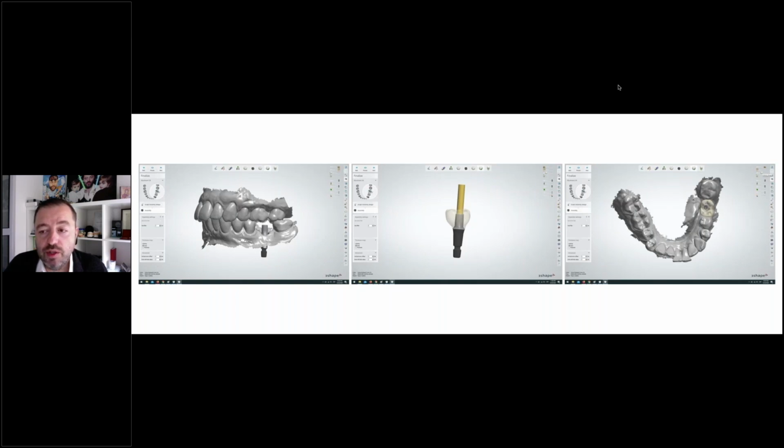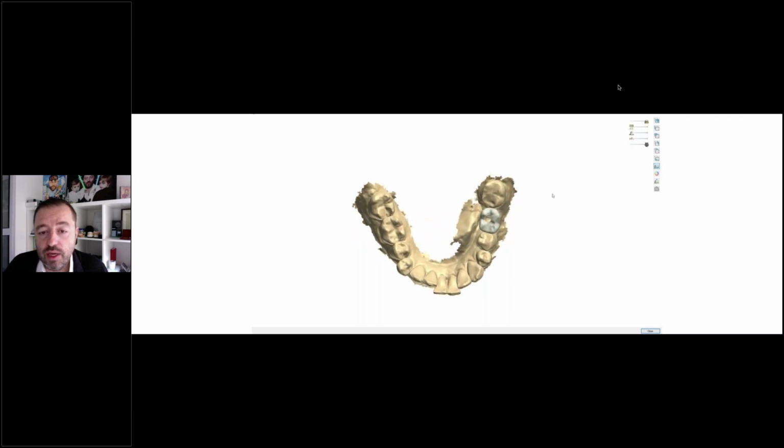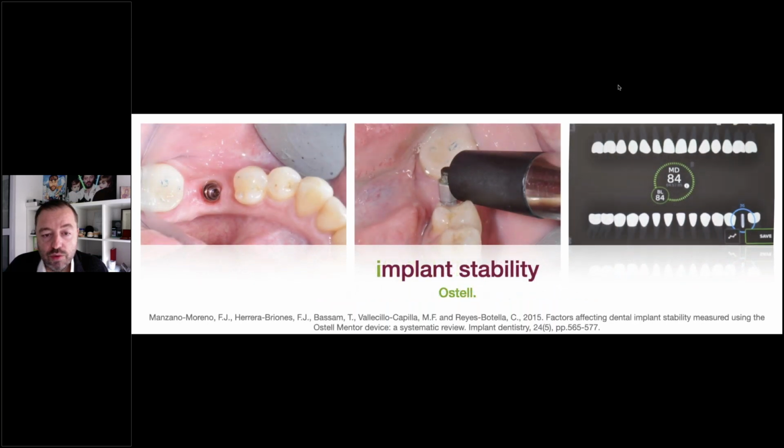And this is the crown creation. We respected the initial digital wax-up that we had. And then we had a new scan, and we used the initial wax-up that we created. And we just printed the model for showing at the courses. So this basically was just to support the idea that we did it in a very precise, totally digital way. The model was not needed. We just used it to be able to show this type of connection and adaptability in this type of courses.